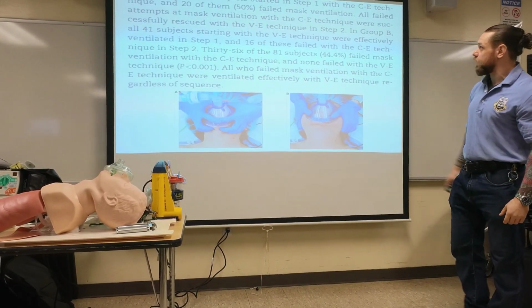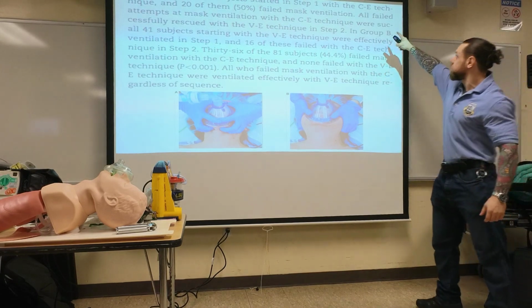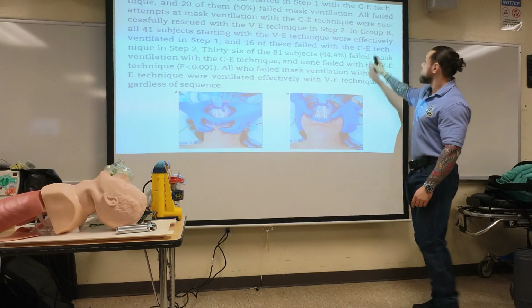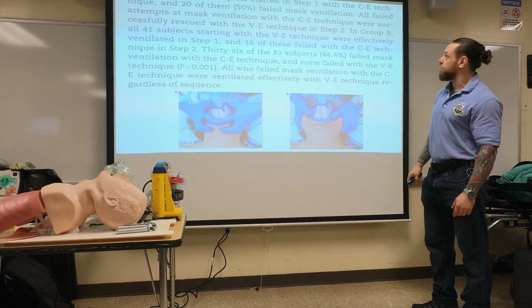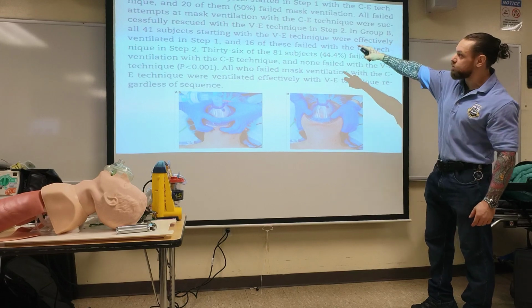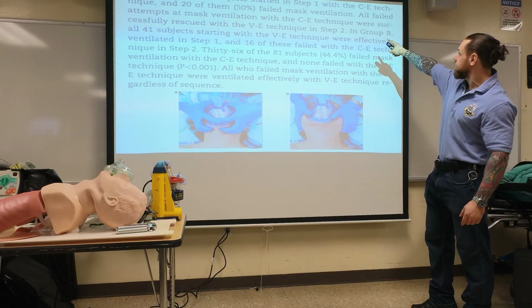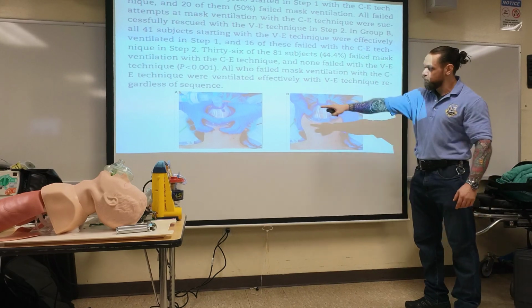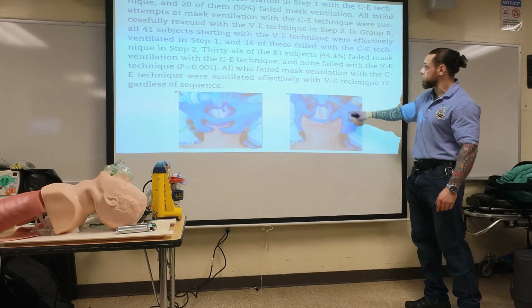And here's the study. They took 40 subjects, and in step 1, they started with the CE technique. 20 of them, 50%, failed mask ventilation. All failed attempts at mask ventilation with the CE technique were successfully rescued with the V technique. So everyone who failed with that was successfully rescued with this in step 2.